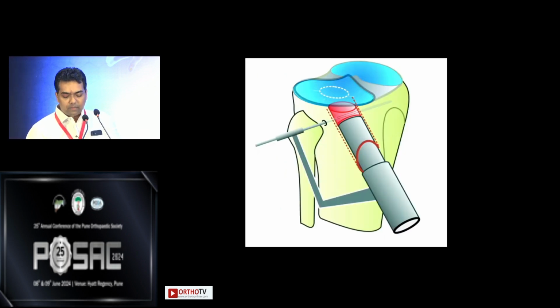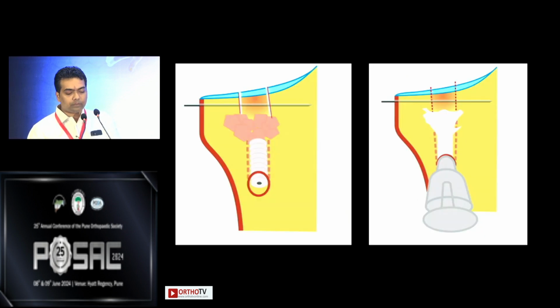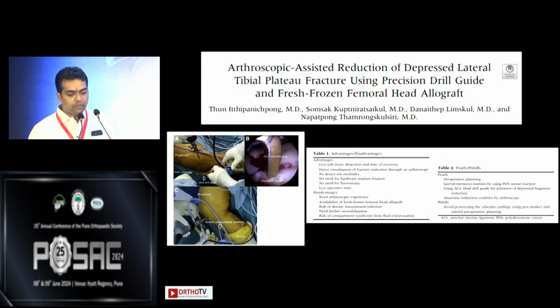There are certain devices which are used by some people to aid in fixing these fractures. We need to fill the void which is elevated, usually with bone grafts. We usually do it with autograft. You can use a bio screw, and inside that you can use cement or calcium sulfate. There are different types of things available.